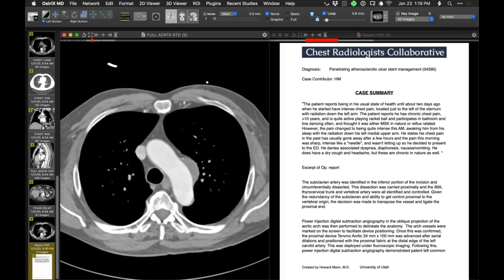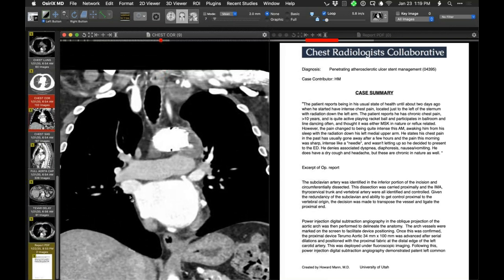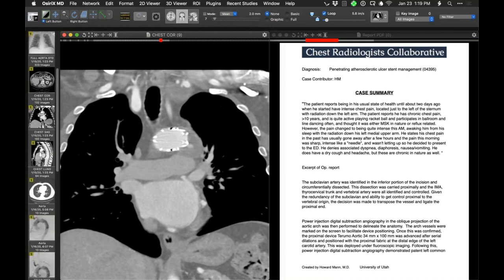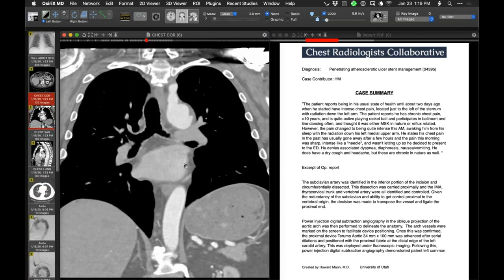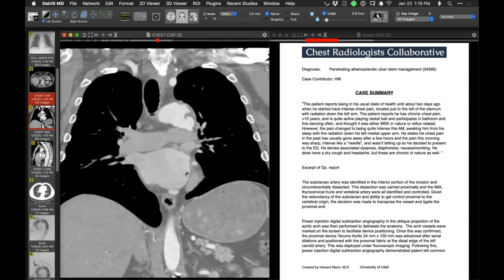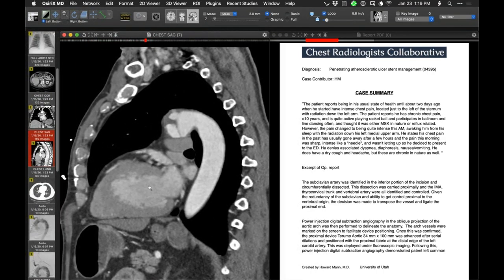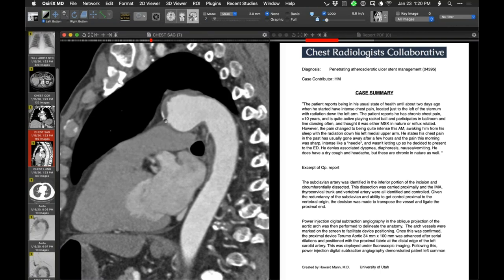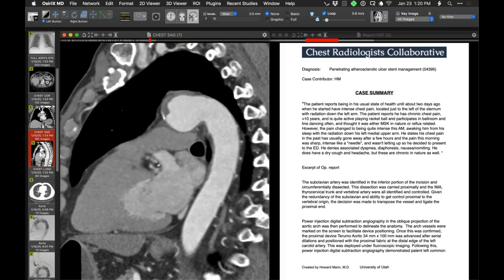Does anyone feel this is not a penetrating atherosclerotic ulcer? Could we see it on coronal or sagittal? I have a feeling this is a ductal aneurysm. I think these are tough — I would probably say if he's symptomatic, it's probably a penetrating ulcer, which may have complicated a ductus bump or ductus aneurysm. There's some intimal calcium and thrombus in there. A penetrating ulcer isn't going to have calcification associated with it — but it could in the periphery.